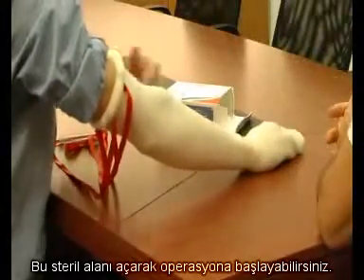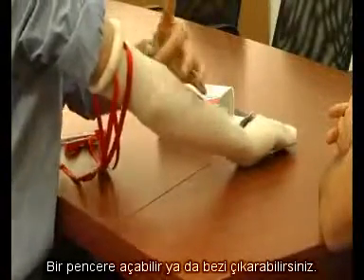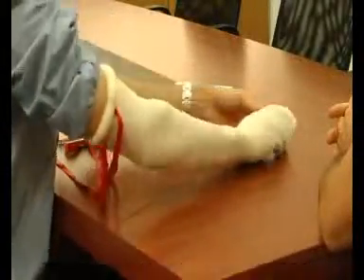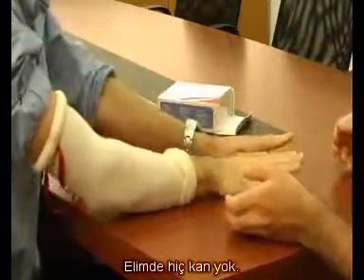And you also opened a sterile field so you can now start the procedure — either by opening a window or taking the stockinette off. It looks very good. Let me see your hand. This is my hand without any blood.